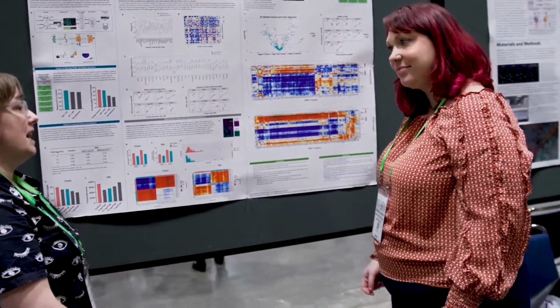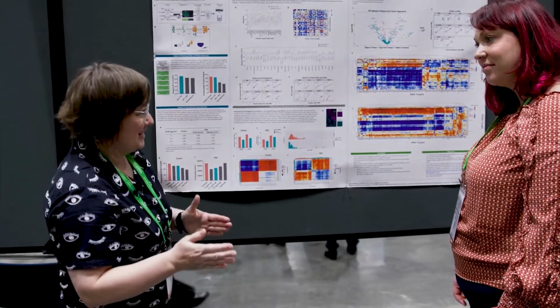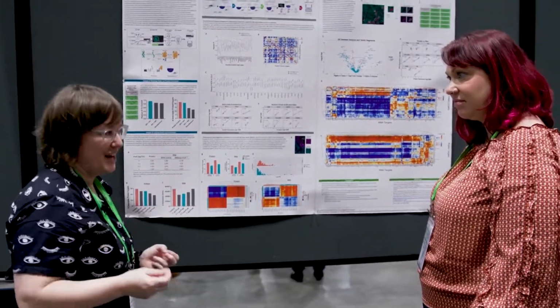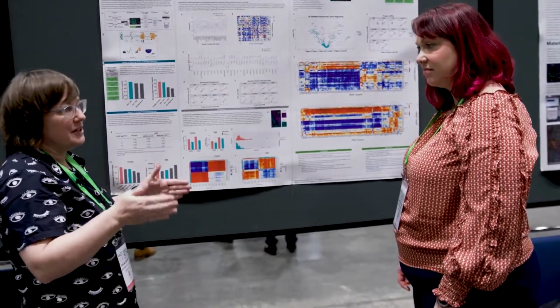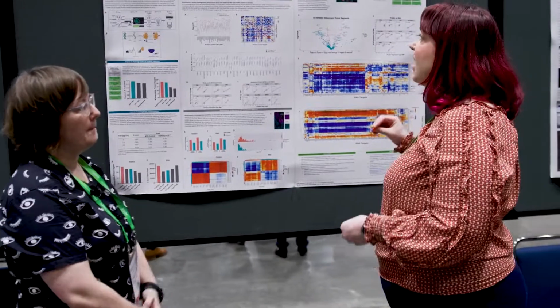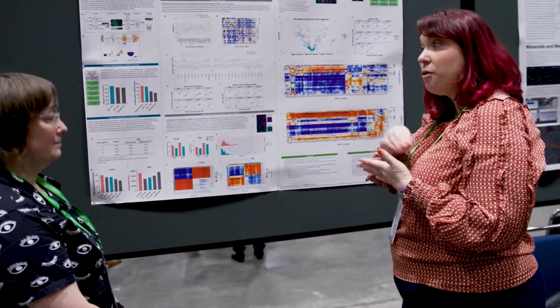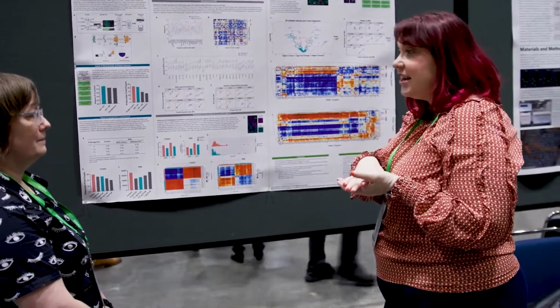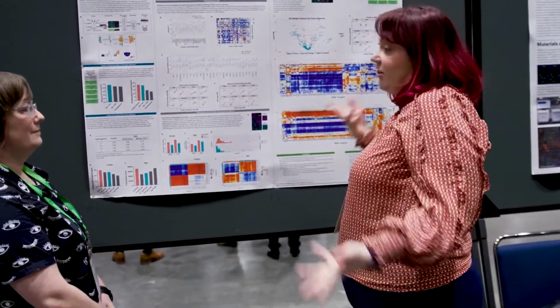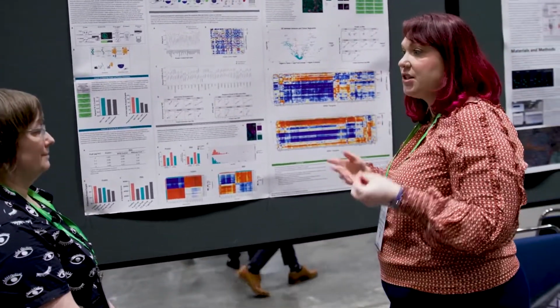Yeah, and it cuts down on the technical variation that occurs between serial sections, because you're capturing the same cell population, which could differ between the two sections. And I think another thing to point out is because GeoMx DSP uses light to profile and section different areas, it's not like laser capture microdissection. Your sample is not destroyed. Exactly. So you can still save it and image it, and use it for another analysis.